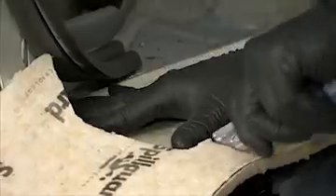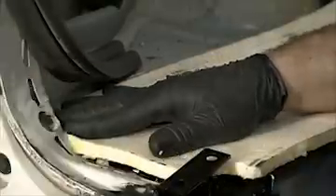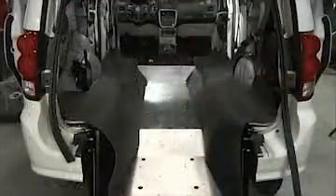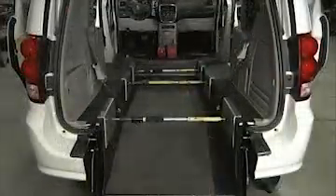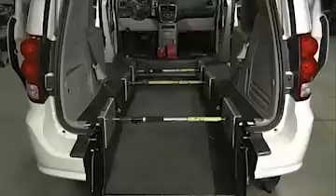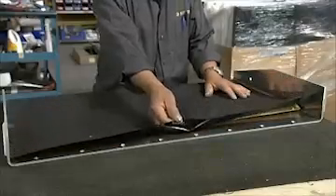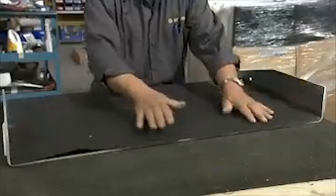After installing the new fuel tank, suspension, and exhaust systems, they return to the interior. A technician fits and bonds carpet underpadding to the van. He installs the carpet and clamps it while the adhesive cures. With the back of the van rebuilt and carpeted, they now ready the wheelchair ramp.